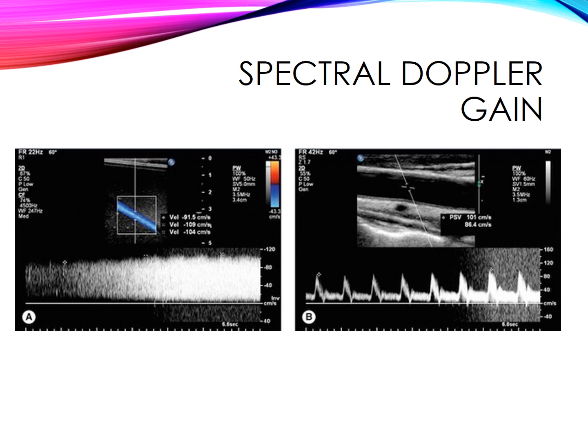So we can see in this first example here, we have maybe a little too light of a spectral Doppler gain, to more of our appropriate spectral Doppler gain, and then getting into our very, very high set spectral Doppler gain. You can see all this little junk hiding behind that waveform. The sonographer measured at different points, with the same blood flow velocity through all of it.